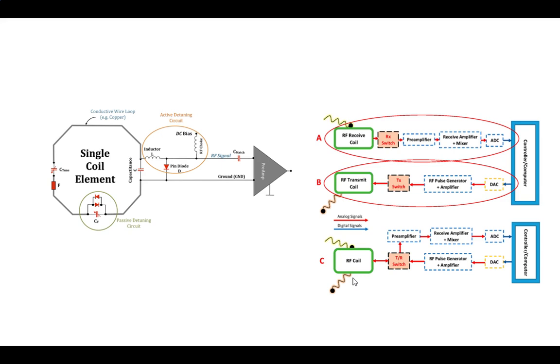So you can think of this passive detuning one as having those sunglasses that change. That's essentially what this one is doing. It's got that capacitor with these two, so theoretically it should let you go either direction you want to. But if you get a really big, powerful pulse coming in, it's going to charge this up, change the capacitance, and detune the whole thing. So it'll kill that signal. That's the whole trick.